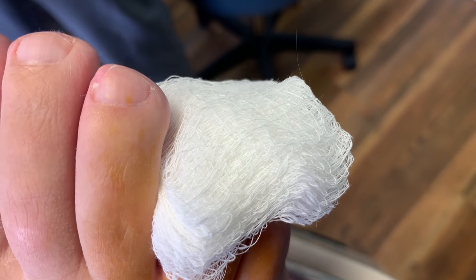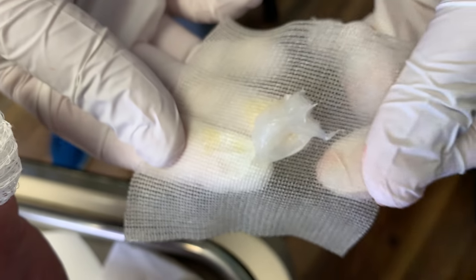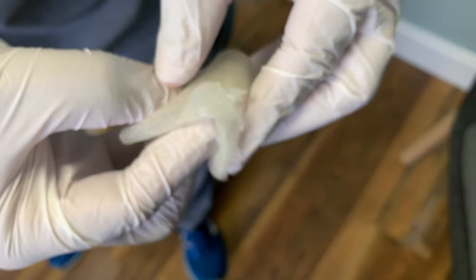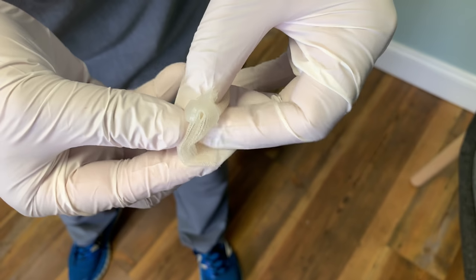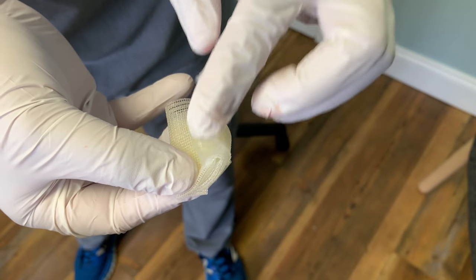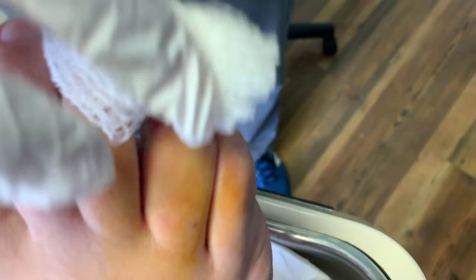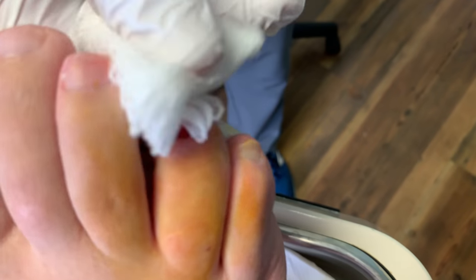So we put some antibiotic cream — bacitracin — and I kind of set it up like this. I get the antibiotic cream, put it on the Adaptic, and then fold it over to make it kind of thick. Now this non-adherent gauze, which is made out of petrolatum, is not going to stick to the wound.